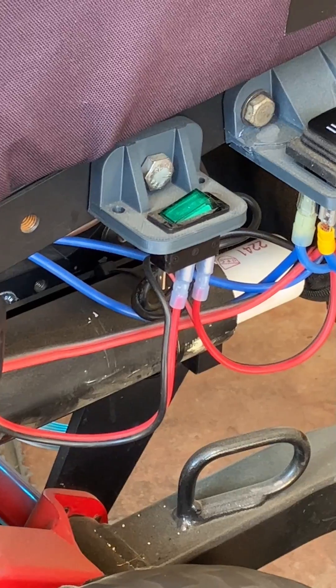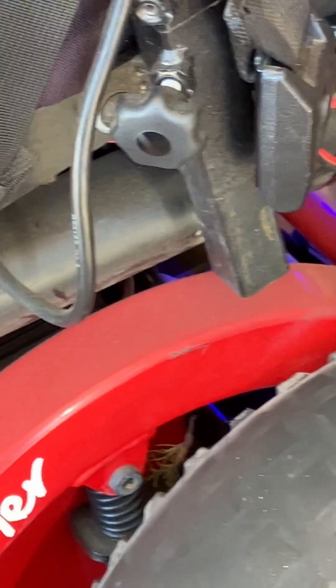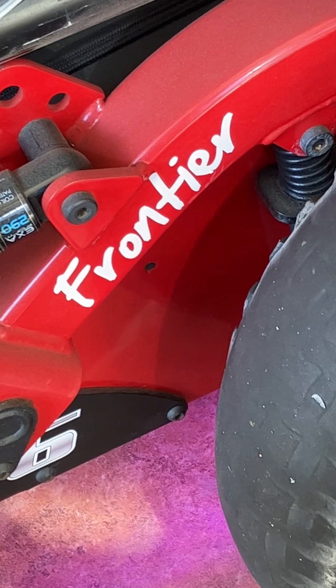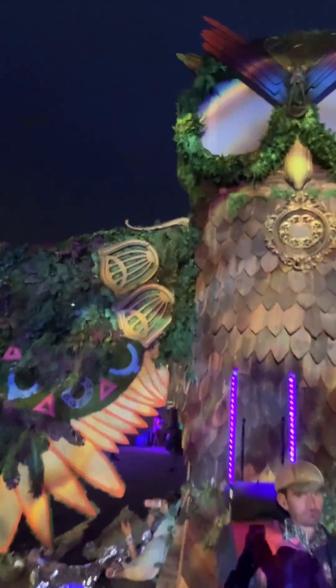The switch I mounted on a 3D printed bracket by my seat and wired it all together. These lights draw very little power — only 5 watts — so you don't have to worry about draining your battery.